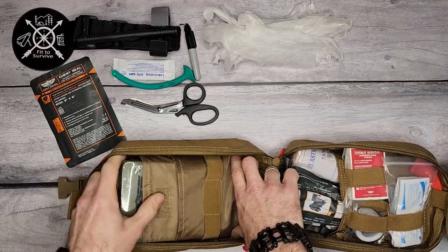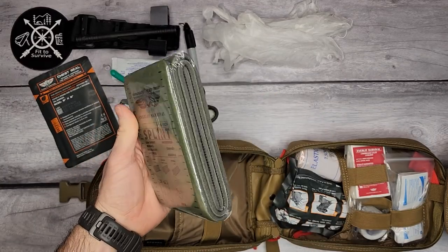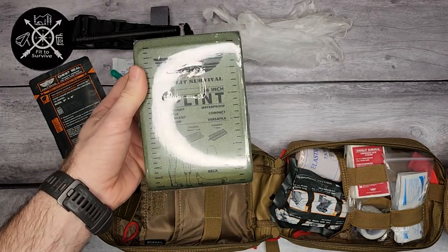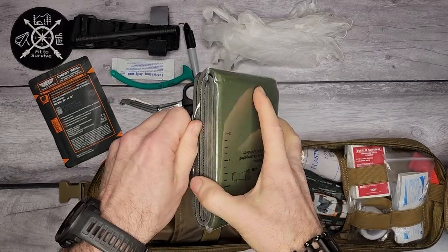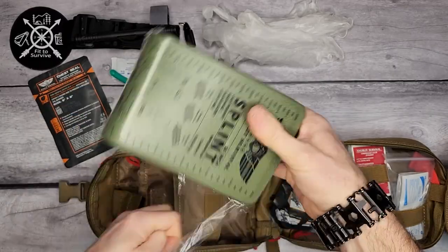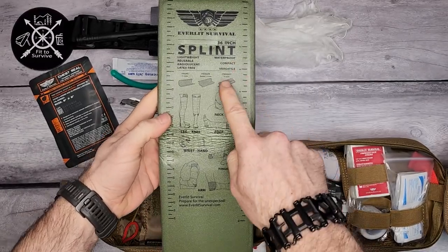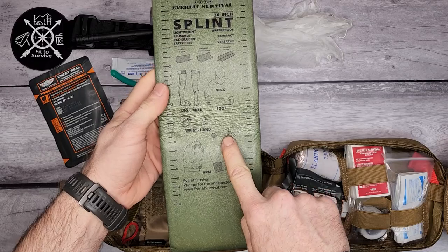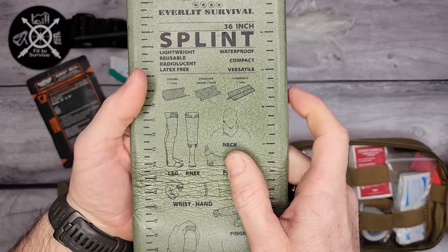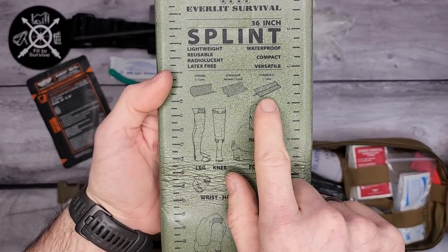In this large compartment is a SAM splint — a large one. This is meant to be used as a splint for a broken arm, broken leg, or other fractures. I like that they printed some instructions right on it showing how to apply it to your arm, finger, wrist, foot, or neck. They also explain how to make it stronger using a C-curve, reverse curve, or T-curve.